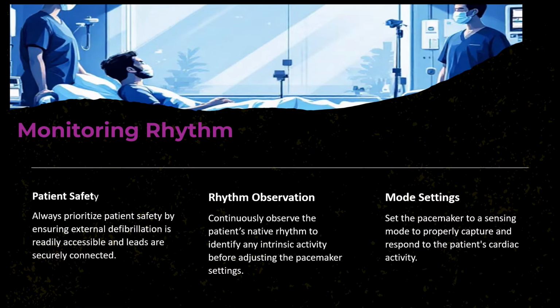Patient safety: we should always keep in mind safety, ensuring an external defibrillator is ready and accessible, and the leads are securely connected. Also, for rhythm observation, we should continuously observe the patient's native rhythm to identify any intrinsic activity before adjusting the pacemaker settings. Mode setting.